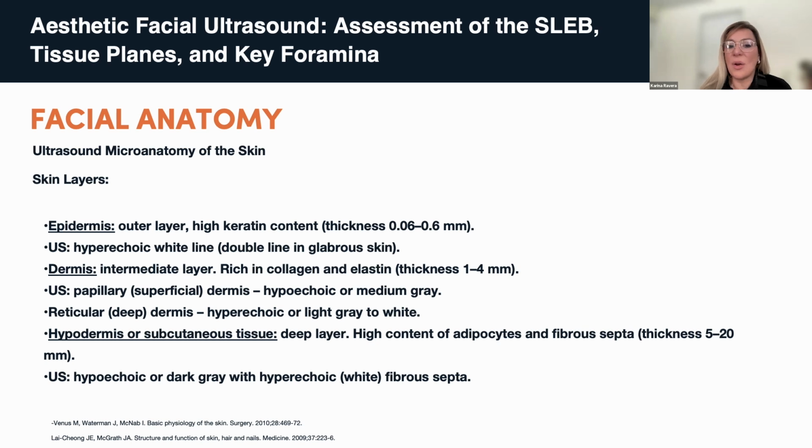It is rich in collagen and elastin, and the thickness is approximately from 1 to 4 millimeters. And in ultrasound examination, the papillary or superficial dermis will look hypoechoic or medium gray, and the deep dermis or reticular dermis will look hyperechoic.